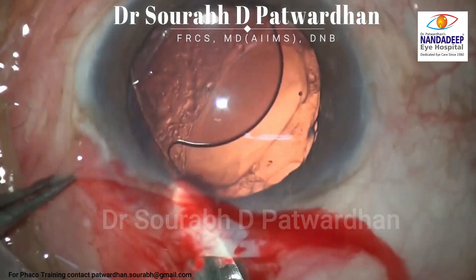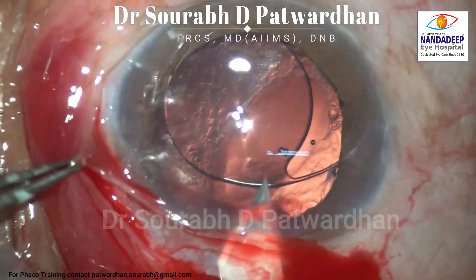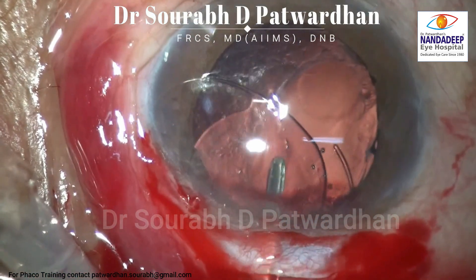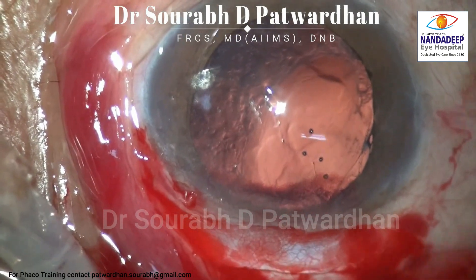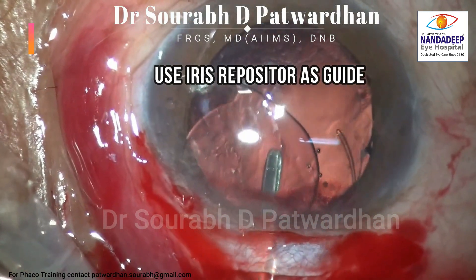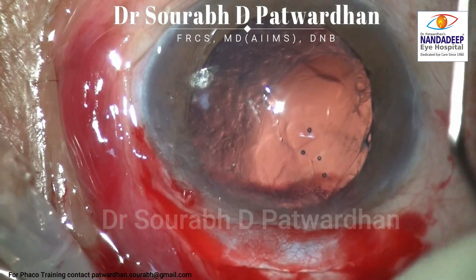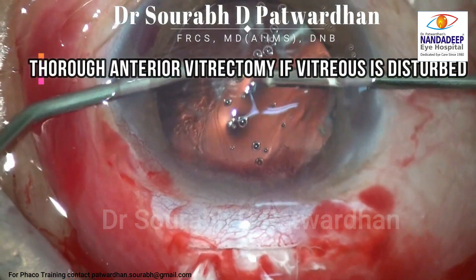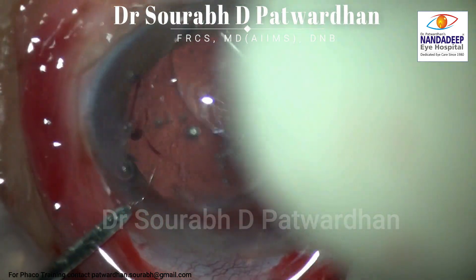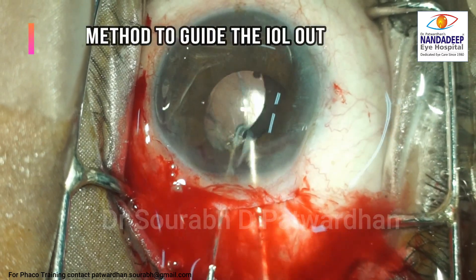This is a subluxated non-foldable PMMA IOL. You cannot cut it and remove it from a small incision, so you have to make a scleral tunnel. Put an iris repositor underneath as a guide and then using a Sinski you can glide the IOL through the scleral tunnel — an elegant way to avoid iris damage. After removing the IOL, if there is vitreous disturbance, vitrectomy must be done. There should be no presence of vitreous after IOL removal.